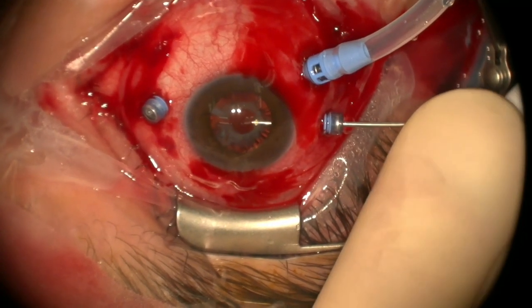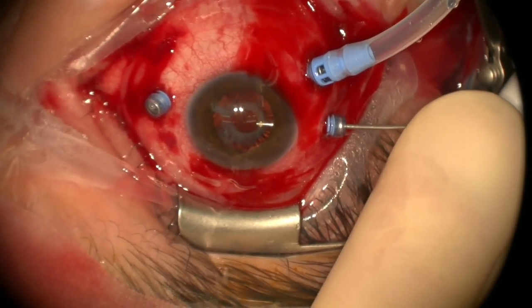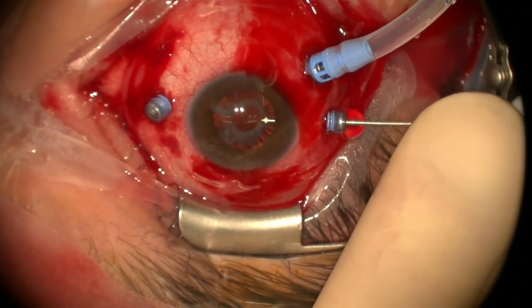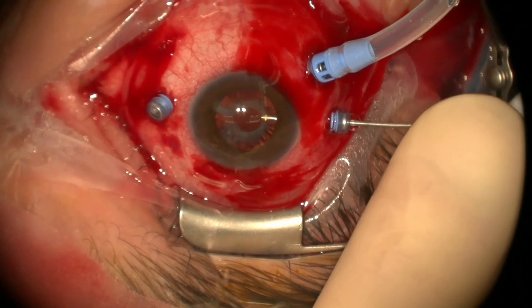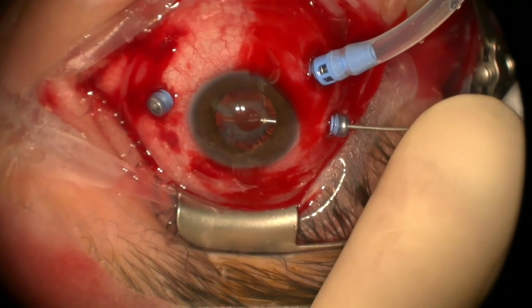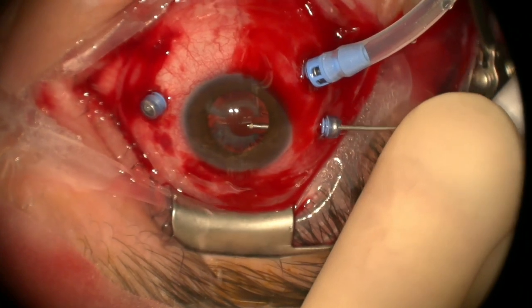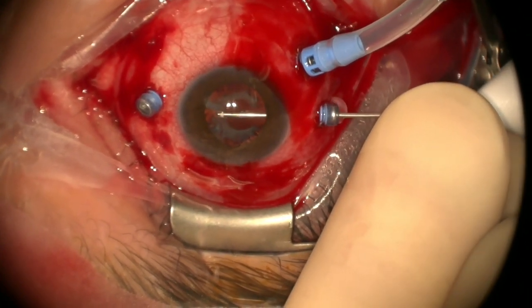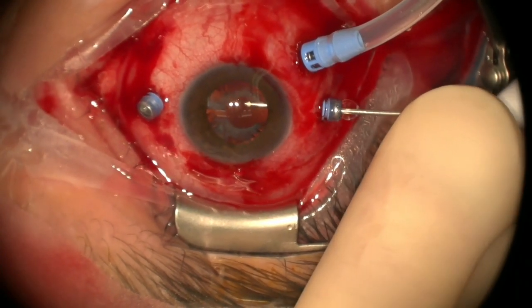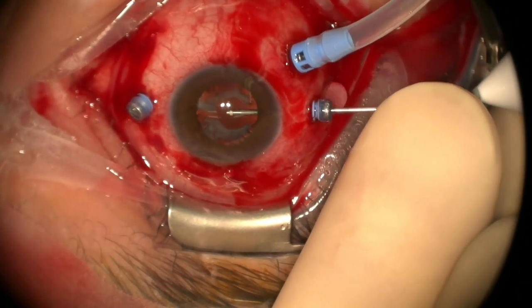It's just a very, they go like capsule phimosis, where the capsule contracts. We're just cutting that edge through. The cutter's not the best at this. You can see it snap open there, right? We just cut both sides, take the traction off. I'm not even that necessarily worried about having to cut the fibrosis off all the way around.